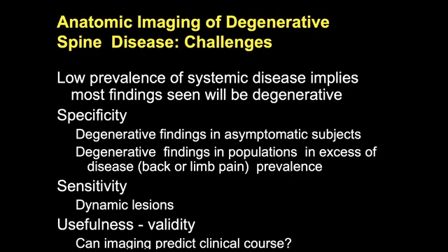And then can imaging predict a response to therapy? In general, the answer is no. So imaging is there to confirm a pretest probability, so evaluated by a spine specialist, preferably, and that person identifies that we're concerned about a disc herniation, and then imaging can confirm that and potentially direct therapy, such as an injection or surgery.